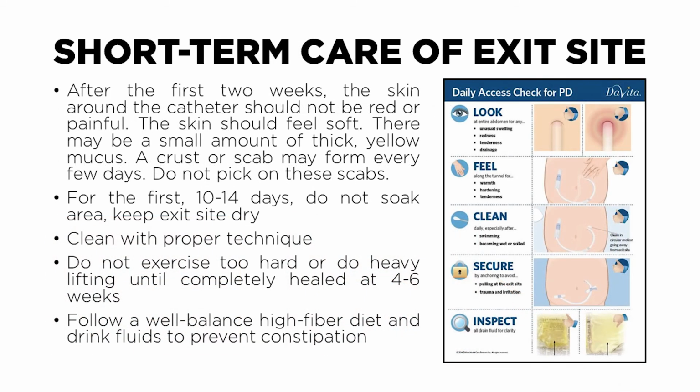Short-term care of the exit site. After the first 2 weeks, the skin around the catheter should not be red or painful, and the skin should feel soft. A crust or scab may form every few days, so please remind the patient not to pick on these. The exit site should be kept dry and must not be soaked during this time. Proper cleaning technique should also be done. Remind the patient not to do heavy exercising or heavy lifting, and constipation prevention is also very important.